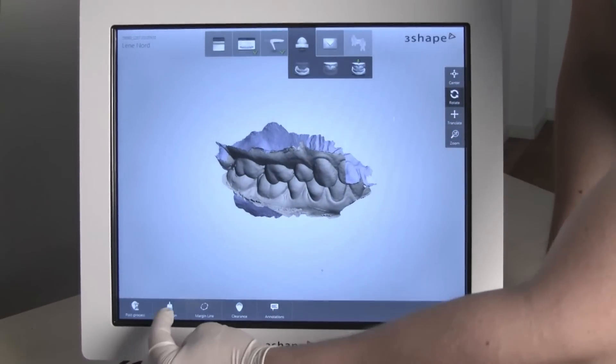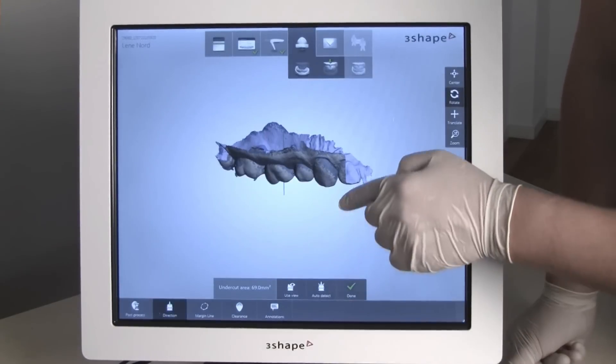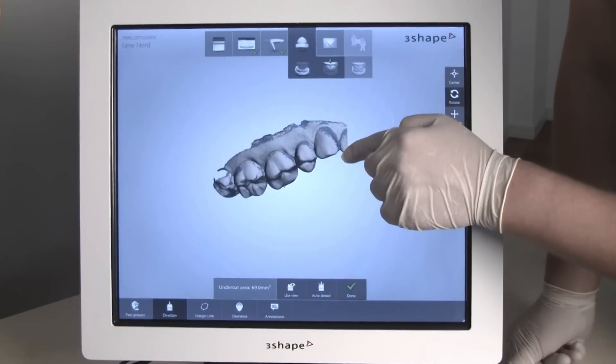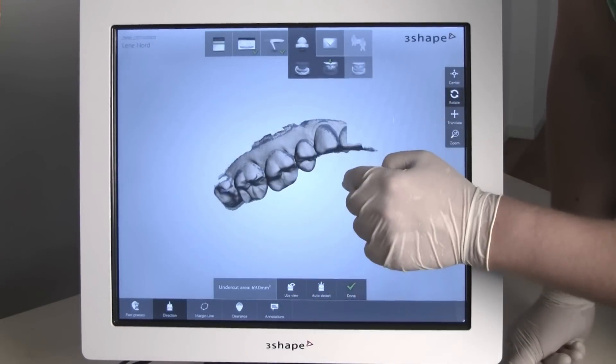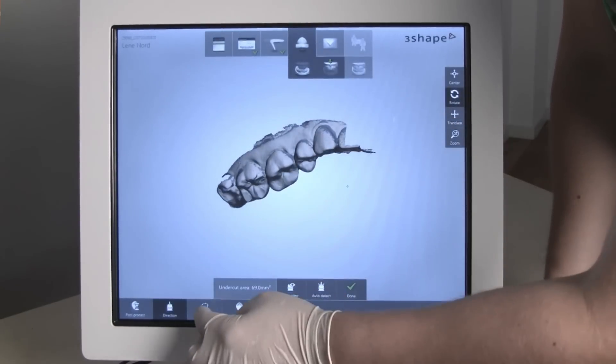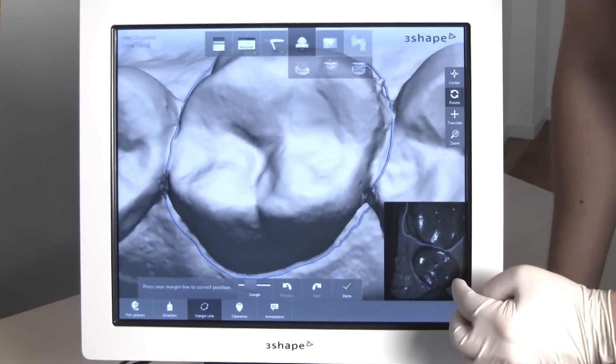When ready, go to the validation page. Here you can check occlusal direction, undercuts, etc. You can also check the margin line and check occlusion clearance.